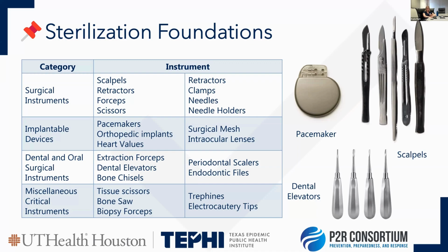So some of these items, and there is a ton of them, especially when you get into very specific surgeries, have very unique devices required for them, like some things with neurology cases with certain implants, some spine things. There's very specific equipment that will be used in these surgical cases. So this is just a couple of the groups looking at your surgical instruments.